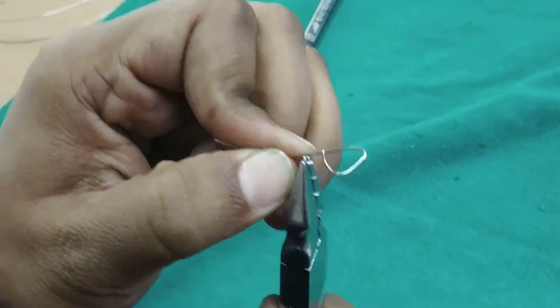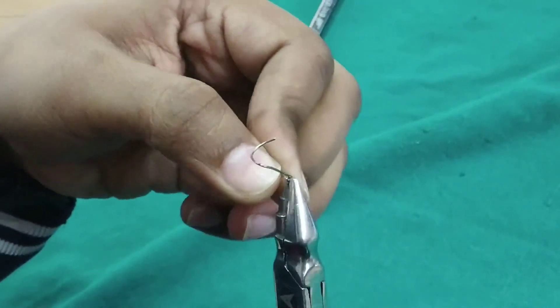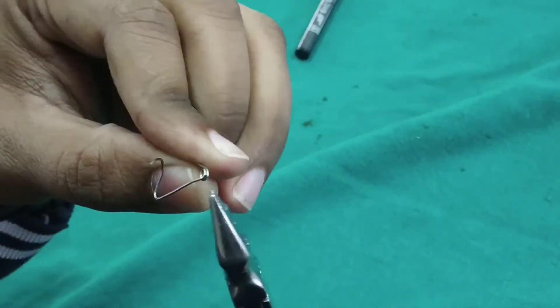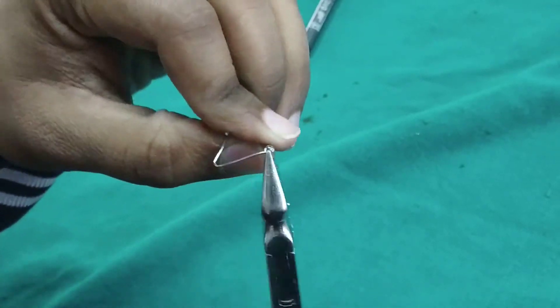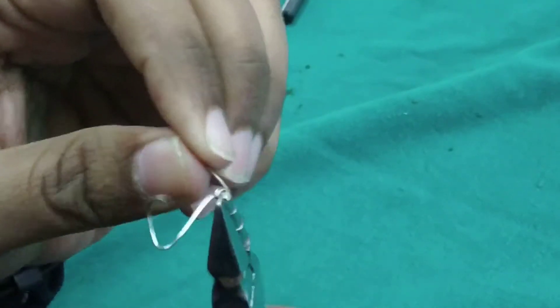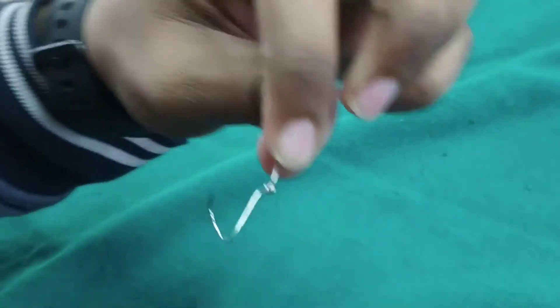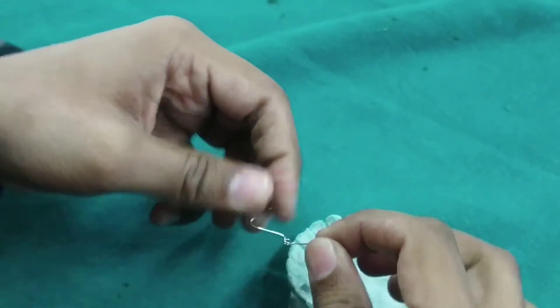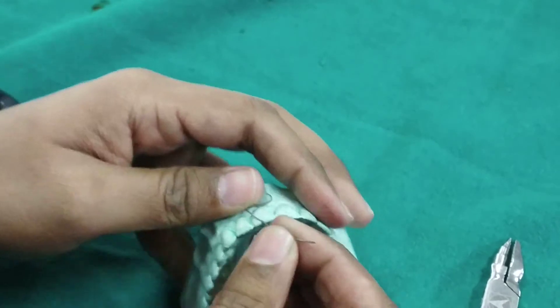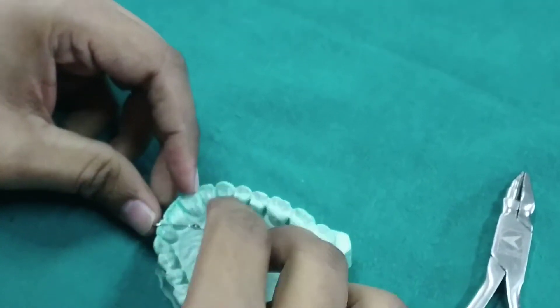Helix is positioned opposite and perpendicular to the intended tooth movement. The helix is placed along the long axis of the tooth to be moved.